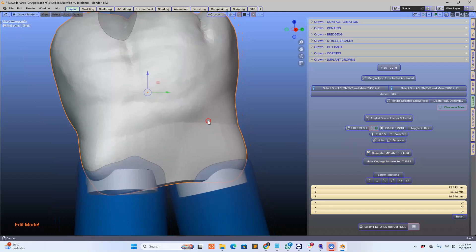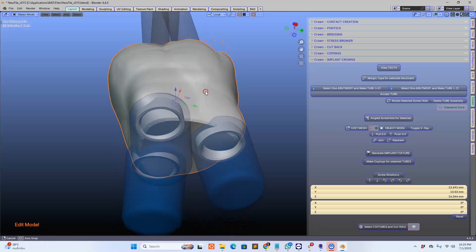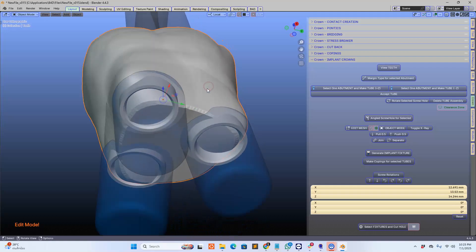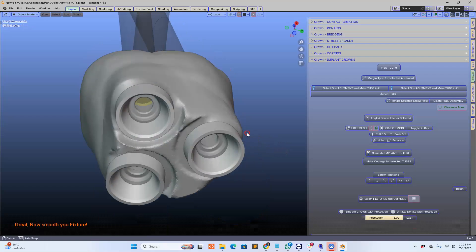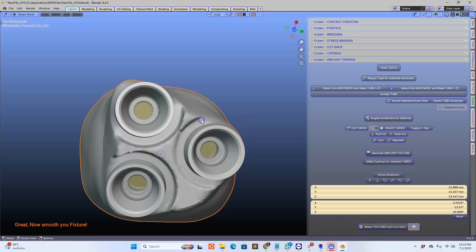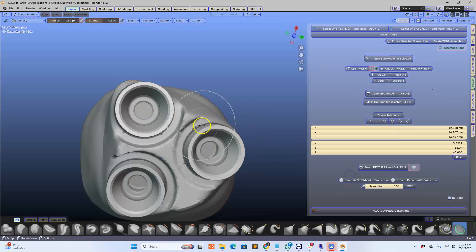Now here comes the big test. I'm going to place it so we can all view this, and hopefully it will work — otherwise I won't post this video. Generate Implant Fixture. Let's go. Perfect. How amazing is that!